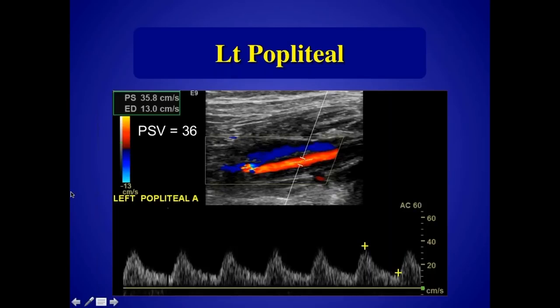As we go beyond the stenosis into the popliteal, notice now very abnormal flow. The velocity is low. We said it should be somewhere between 60 and 80 centimeters per second. Here it's only 36. Waveform, very abnormal, not triphasic, low velocity, slow rise to peak systole. The tardus parvus waveform, TP shaped, tells us there's an inflow lesion, just in case we missed it.